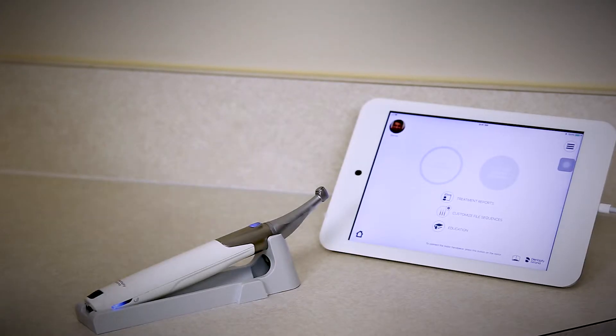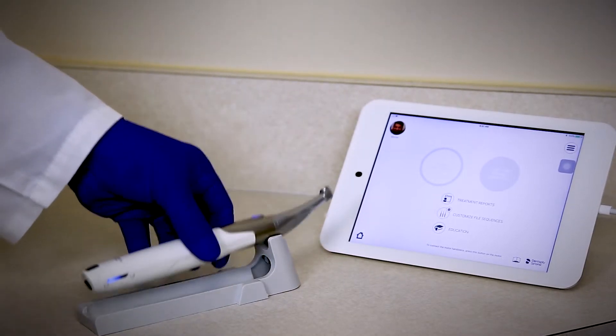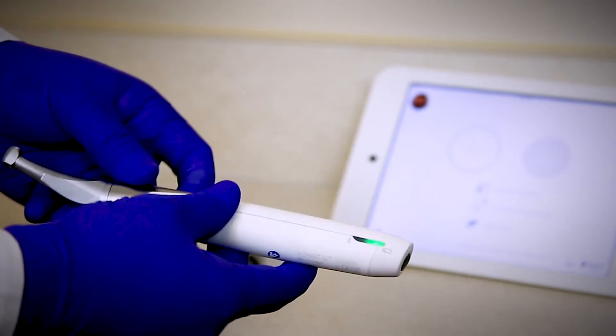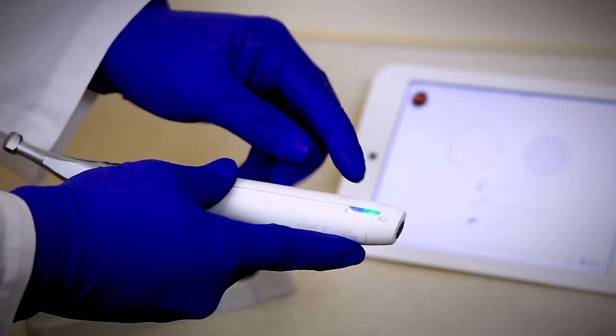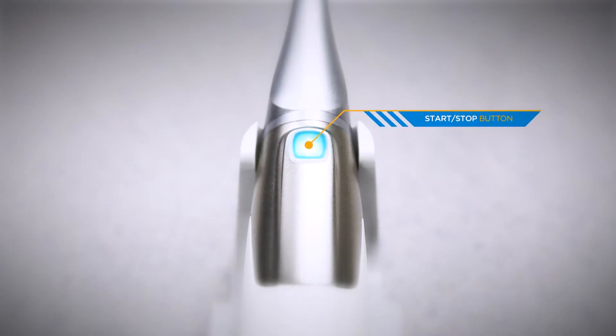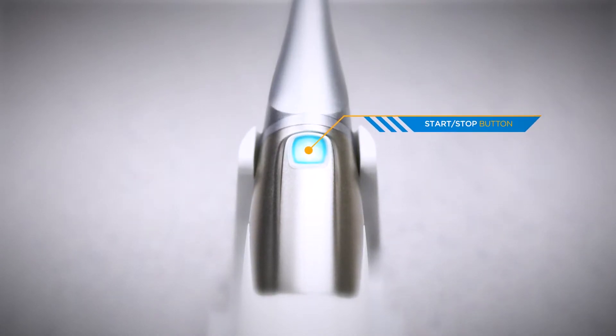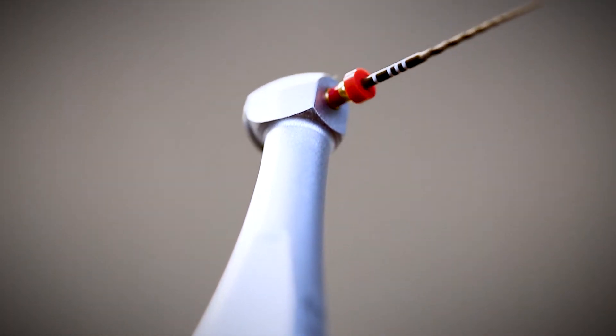To wake it from standby mode 1 you pick up the motor handpiece. To wake it from standby mode 2 you must press the multi-function button. In the center of the motor handpiece you will find the start stop button. This is used to start and stop the rotation of the motor.